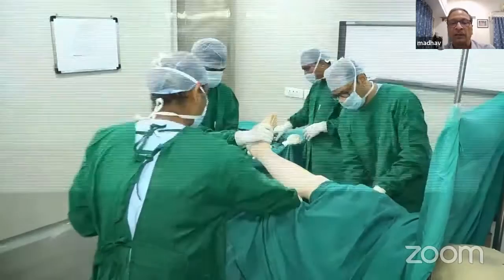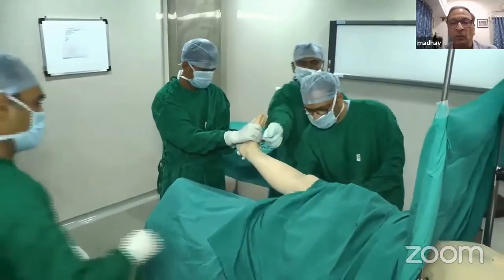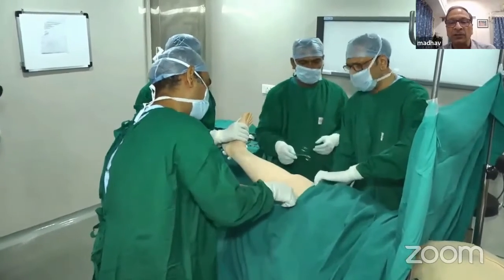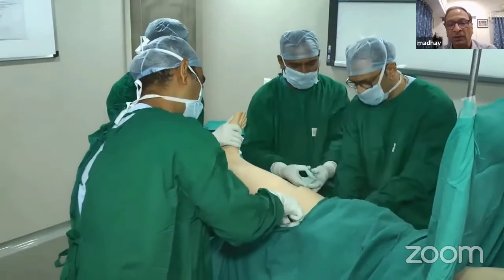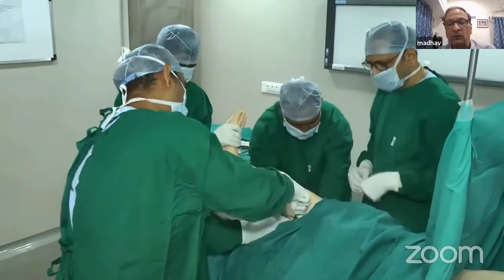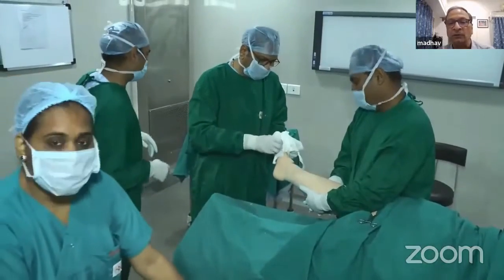Now take one more sheet from the upper side, and medially and laterally secure these two sheets — one from below and one from above — with towel clips. So now you have two layers: the first one was inside, and now these two sheets have covered it.